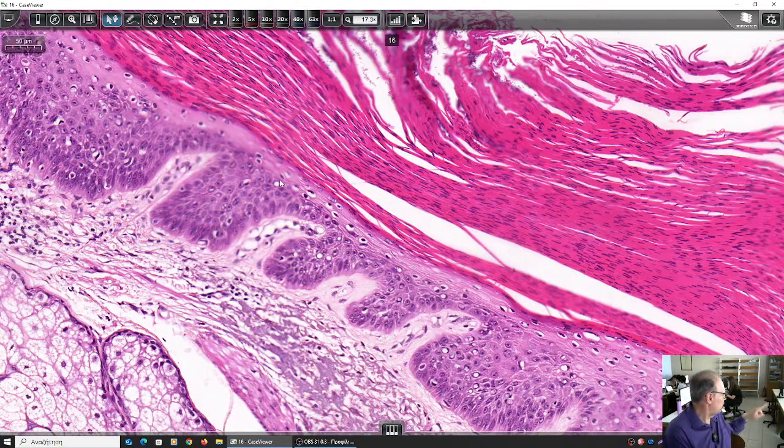Why is it not cancer? They do not invade. They do not break the basement membrane and go into the dermis. So there is no invasion. So remember from our general courses of general pathology of neoplasia, how do we call an intraepithelial, a pre-invasive neoplasia? What's the term in pathology to describe these cells? They look malignant, they may have a malignant potential, but at the present time, they do not invade. So how do we call them in pathology?